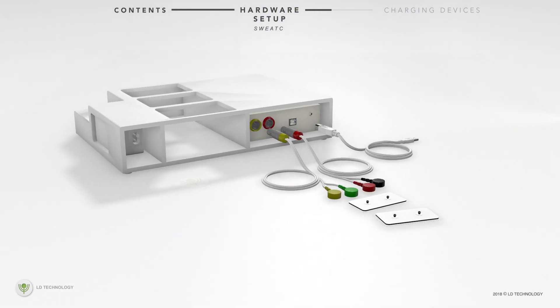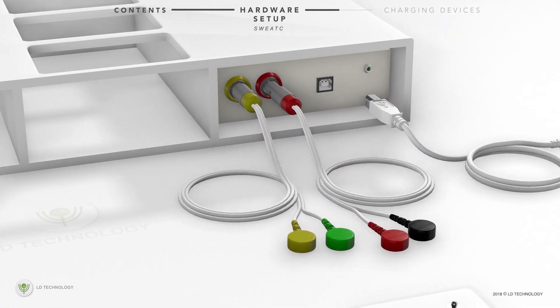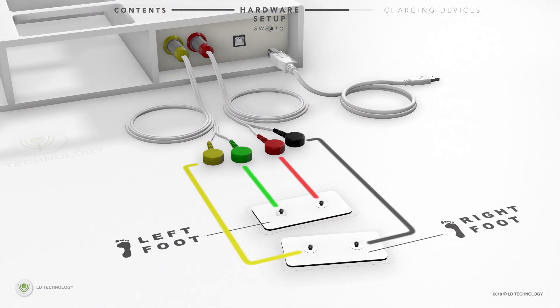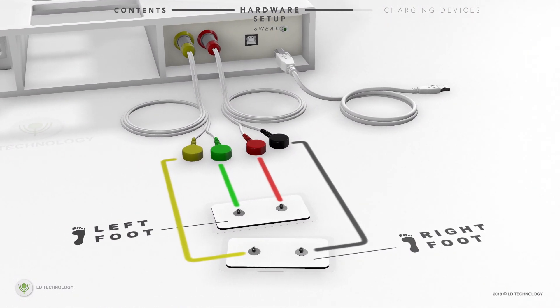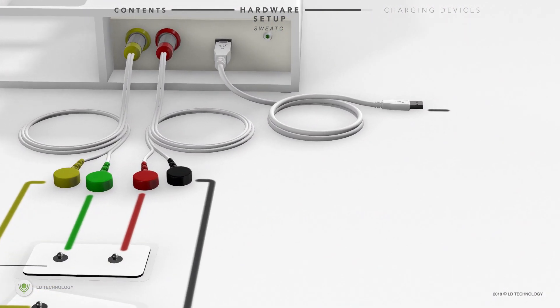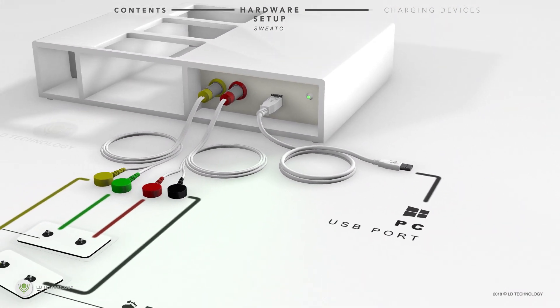Next, connect the GSR cables to the back of the GSR box according to their color code, and then connect the cables to the two electrode pads: black and yellow on the right foot pad, red and green on the left foot pad. Next, connect the USB cable of the GSR device to the PC USB port.